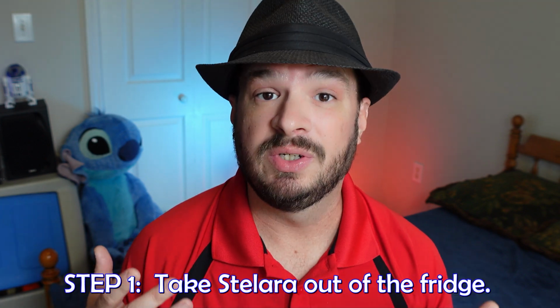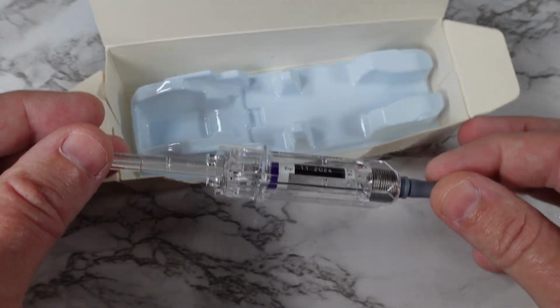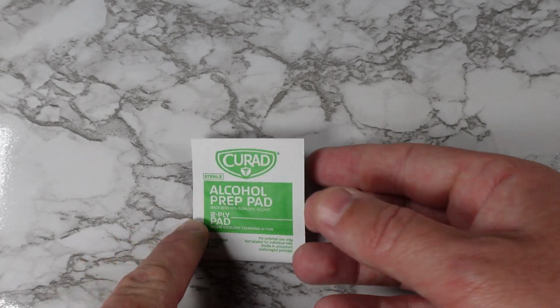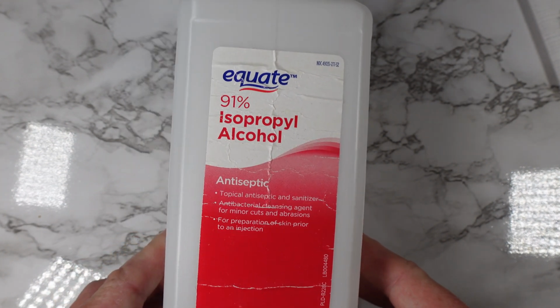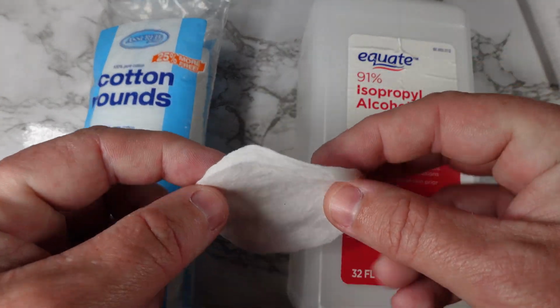Stelara has to stay refrigerated until it's ready to be used. So step one, of course, is going to be to take it out of the refrigerator. Allow it to stay out for about 20 minutes or so it can reach room temperature. While you're waiting, make sure that you have the materials that you need to clean the injection site. I always use an alcohol pad, but if you don't have an alcohol pad, you can always make your own. Just take a basic bottle of rubbing alcohol and a cotton ball, or I like to use these cotton rounds that work perfect for the process.